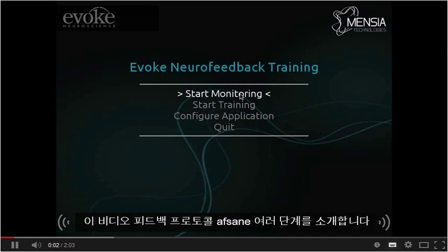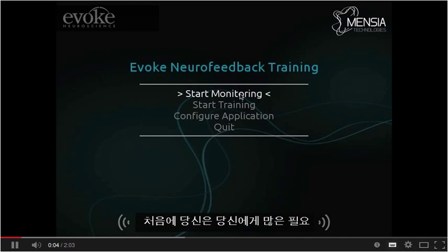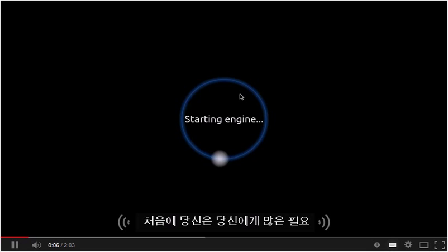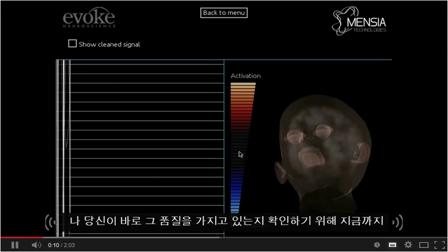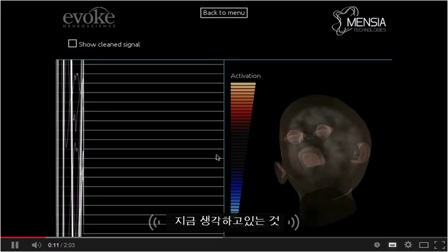This video introduces the different steps of a neurofeedback protocol. In the first place, you need to monitor your EEG data in order to make sure that you have a great quality of signal.